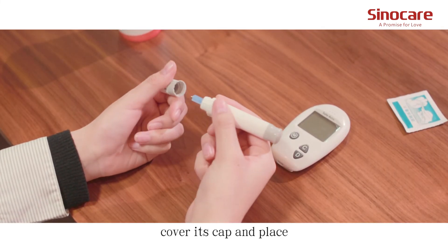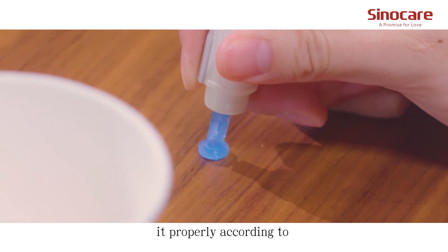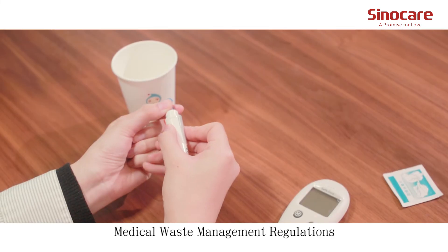Twist off the lancet. Cover its cap and dispose of it properly according to medical waste management regulations.